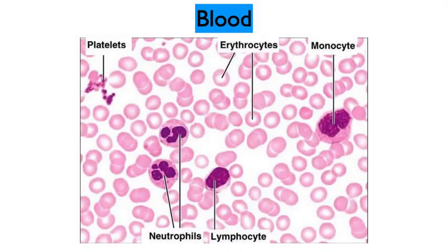And funny as it seems, blood is considered to be a type of connective tissue. Here you can clearly see all sorts of red blood cells. Remember, they're biconcave, they're enucleated, they don't have any nuclei in them. And then you see some other components of blood, for example, the platelets that allow clotting to occur. You have white blood cells. Here we have a couple of different types. We have monocytes, neutrophils, lymphocytes, and they tend to have very characteristic profiles, which would make them easily identifiable.